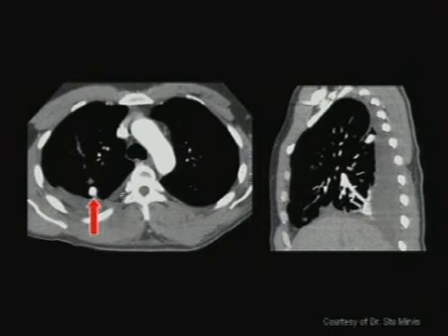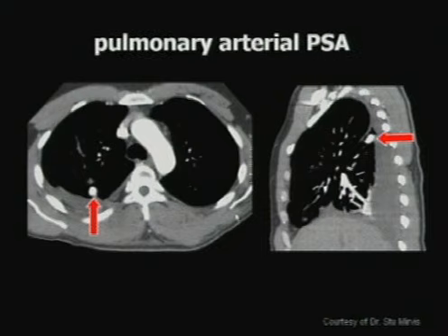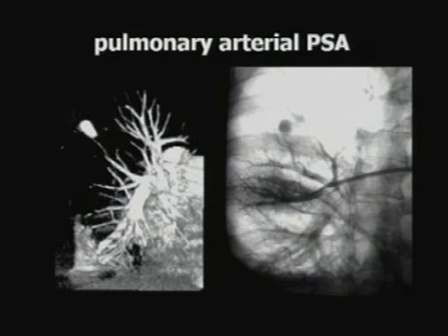We had this little light bulb go off in the right side of the patient's chest, and on the sagittal images we saw it in the superior segment of the lower lobe. Small hemothorax as well associated with this. This turned out to be a pulmonary artery pseudoaneurysm. 3D images were very nice to demonstrate its connection with the pulmonary arterial tree, and verified again on the angio where the angio guys were able to coil this. A little strange bit of trauma, but it's out there.